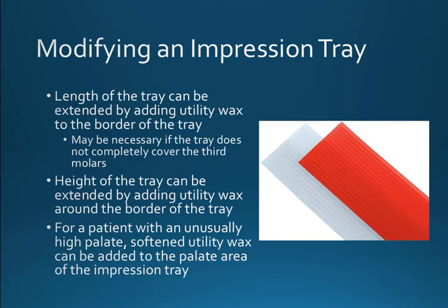And for a patient with an unusually high palate, you can also use softened utility wax and add it to that palatal area of the impression tray. That'll raise it up so that you can ensure that you're getting the full palate.